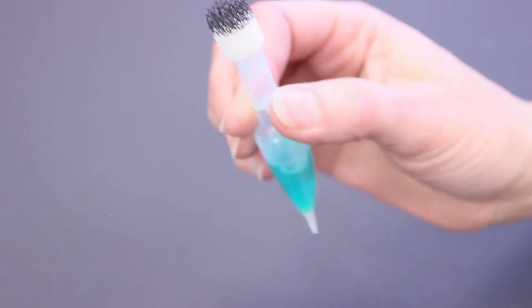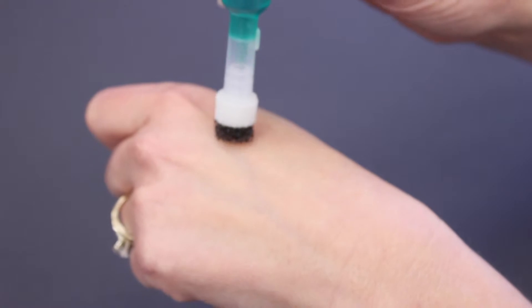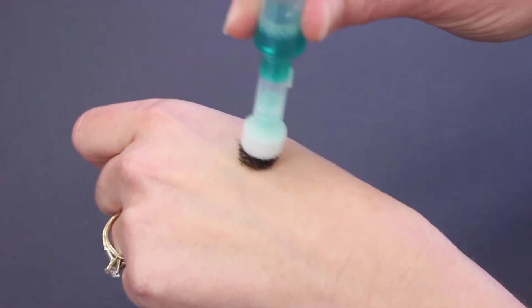To activate the tube, squeeze the tab on the neck to crush the inner web, then squeeze the body of the tube just enough to moisten the applicator and apply.